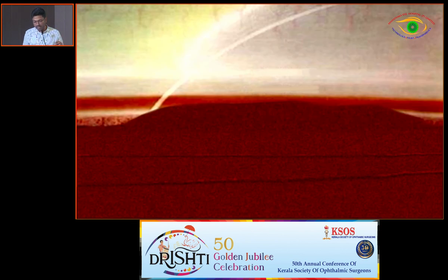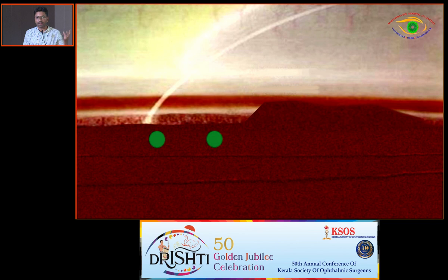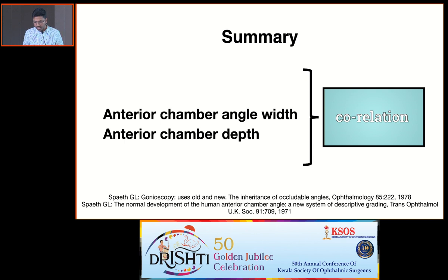Again, to see what is happening to the peripheral anterior synechiae with the application of laser, I'm just demonstrating this animated concept. See nicely, whenever the laser is applied, the PAS is shrinking, which is giving way for aqueous to drain.